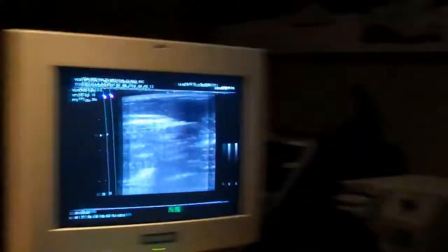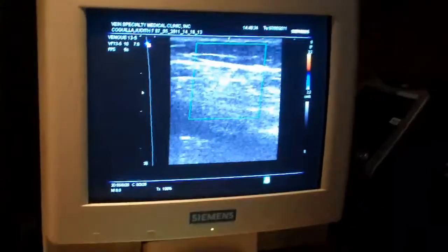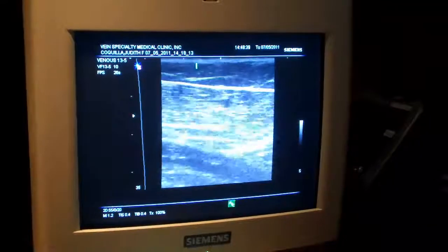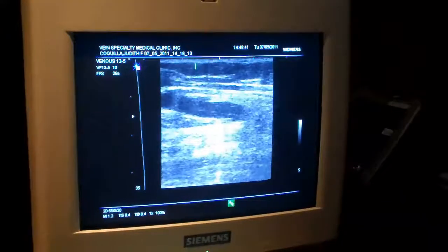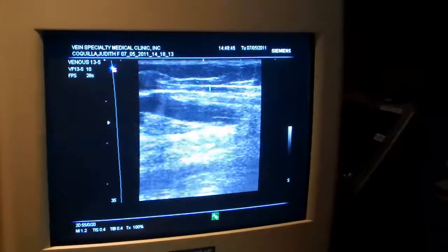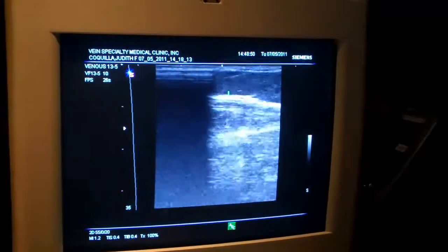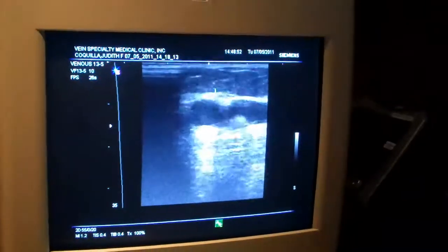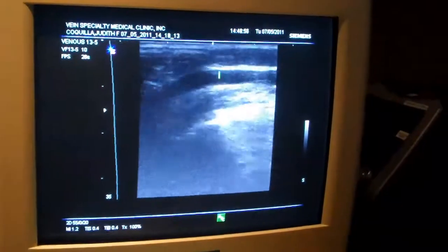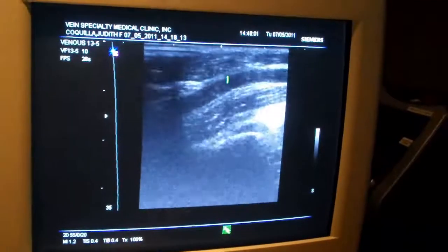And look at that. So that's the short saphenous, which you can see brings no color now. Okay, this is the short saphenous. It's very, very small, and it is competent. It's not a problem. As we go to the side a little and up, then you find the varicose vein here, lateral upper calf. And if we trace it higher, then you see it turns into, it's receiving its reflux.